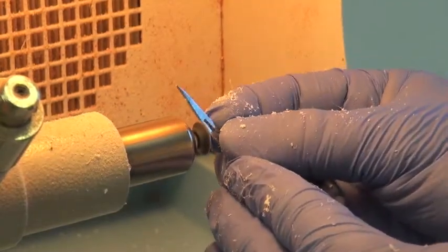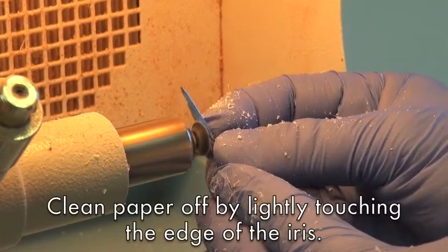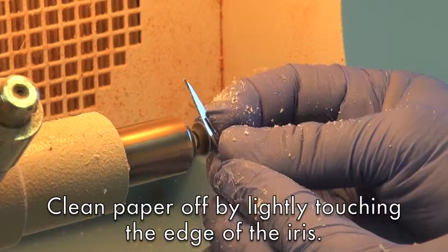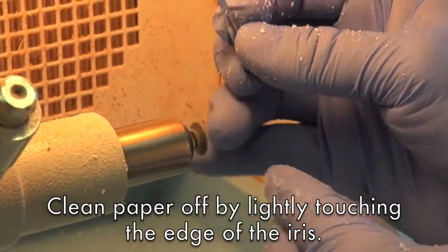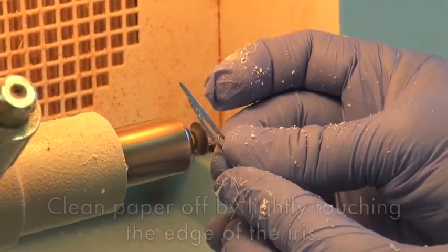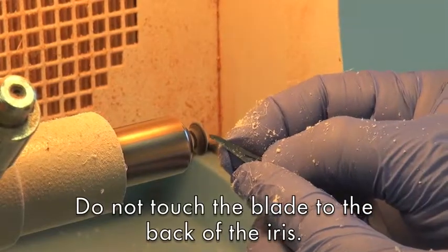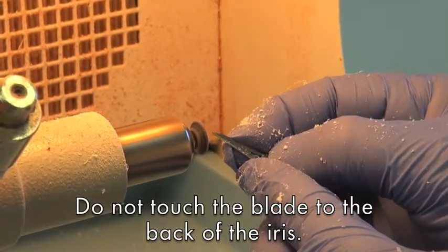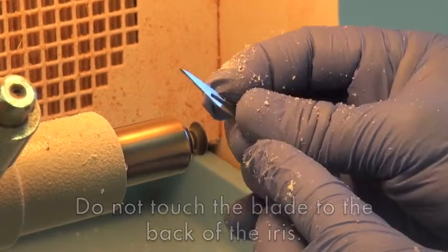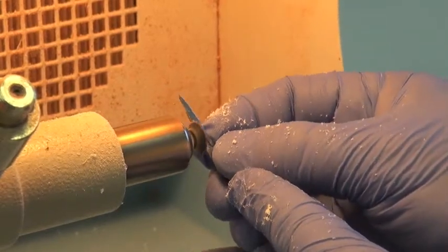I'm going to just gently clean any paper off the outer edge by lightly touching the back of the edge with my blade to remove any paper. I am not touching the image in any way with my blade on the backside, just removing the paper from the edge.